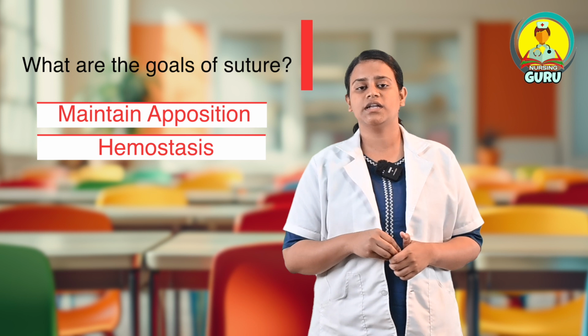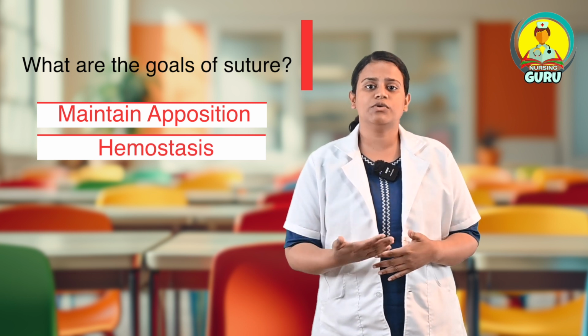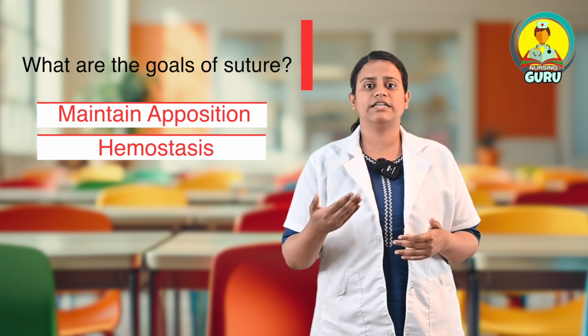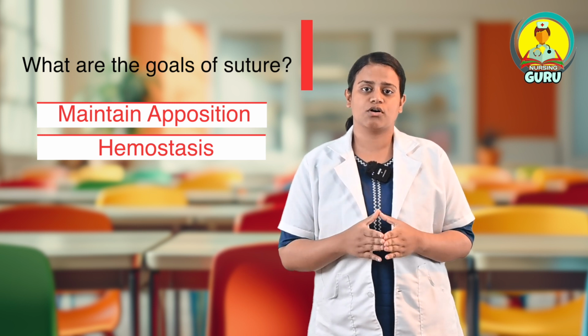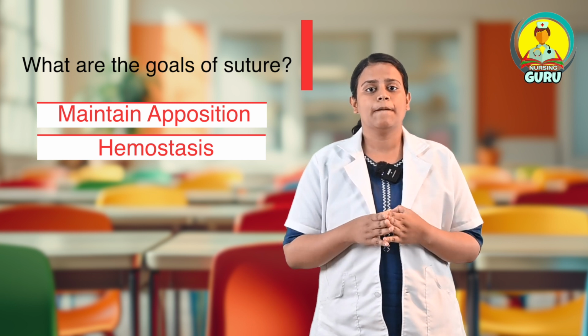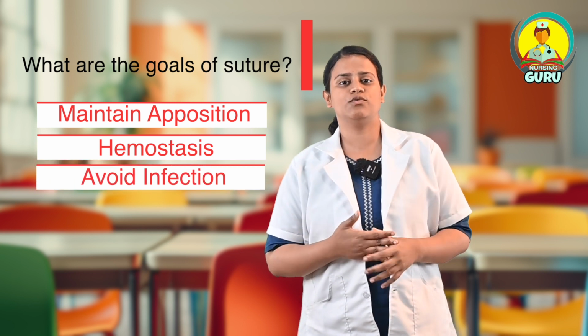Hemostasis is nothing but stoppage of bleeding, or preventing the wound from too much bleeding. Increased bleeding will lead to a hypovolemic condition, and the patient may go into severe shock. That is why we do suturing, so that it can prevent the bleeding. Then we do suturing to avoid wound infection.